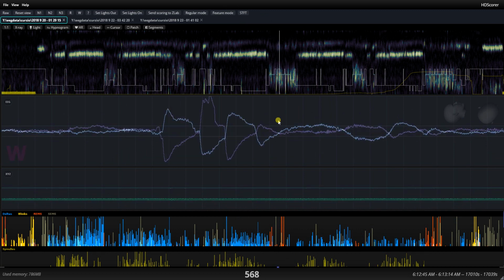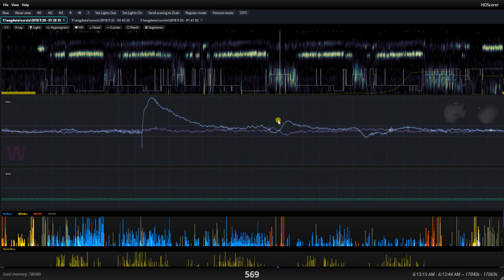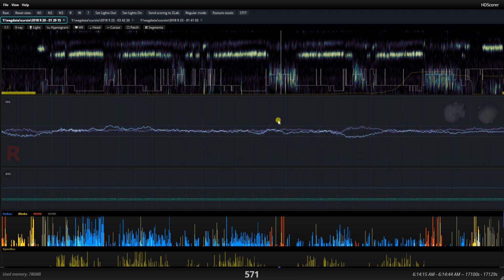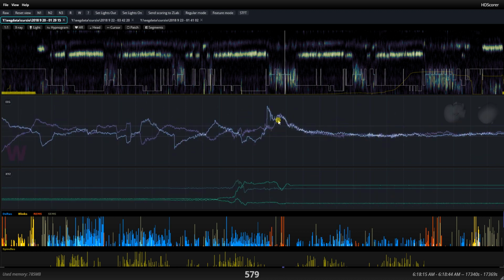Then what have we got here? Okay, this is an epoch that got misscored. So this is, instead of being wake, this should definitely be REM. I'm not sure why it got classified as wake, but I would change that and make it REM. Okay, so we got two epochs that I manually changed.